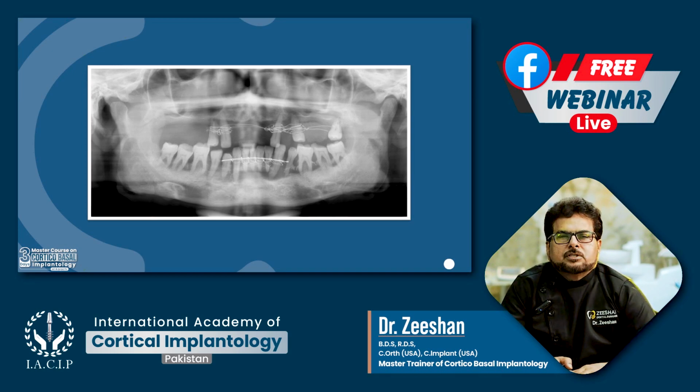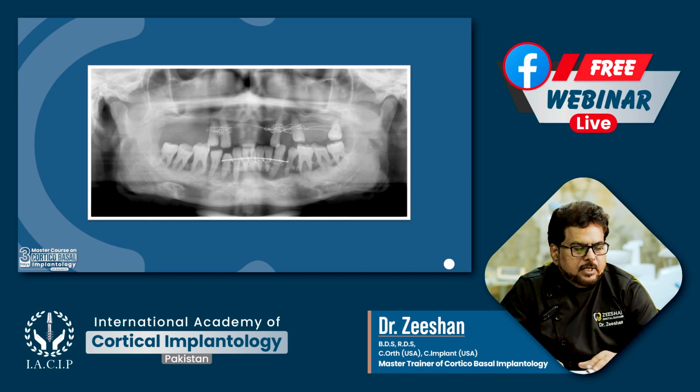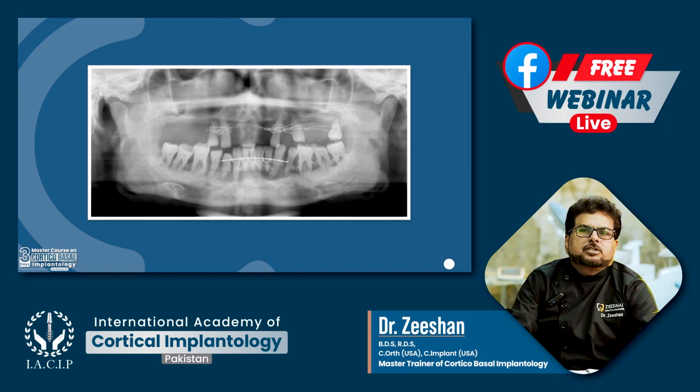To achieve that primary stability, you have to choose longer implants, but bone is not allowing, bone is less, so you have to have a tilted approach. Tilted approach means angular implants. You have to place at an angle, not straight, not vertical. So to reach that goal, how will we achieve it?